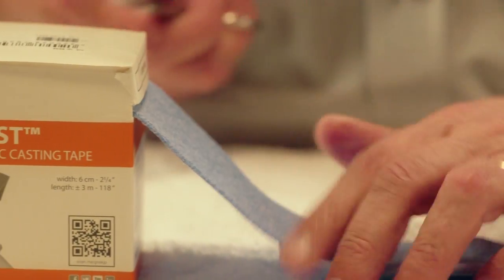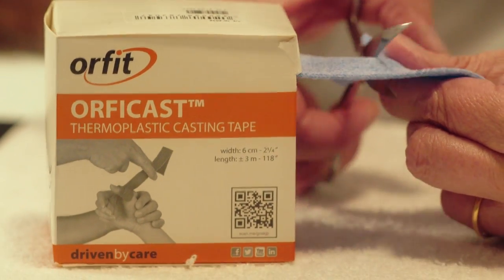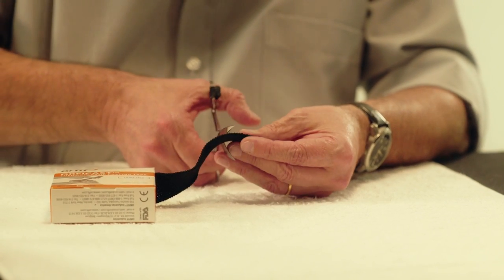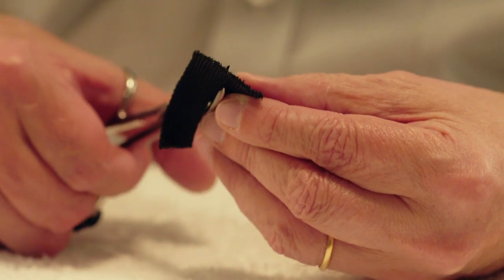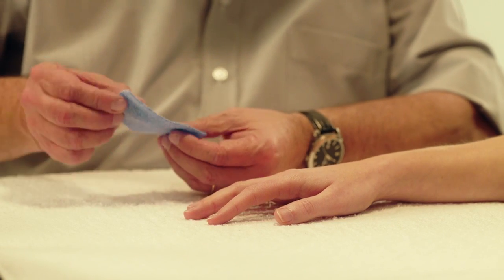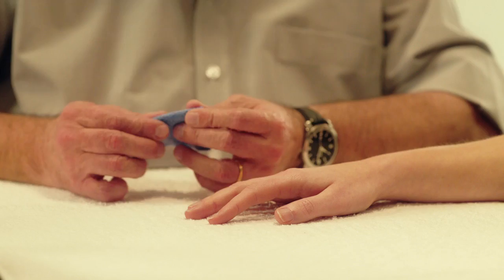Use a strip of Orphicast 6cm wide and 10-12cm long, and a second strip of Orphicast 3cm wide. Cut the 3cm piece in two lengthwise. Heat the 6cm Orphicast and fold it in half lengthwise.